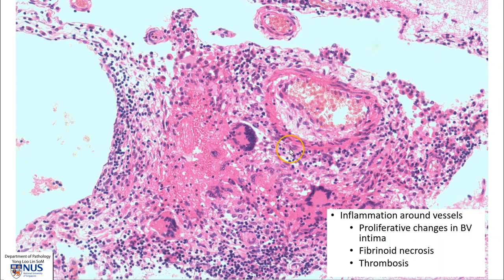Here is one example of a blood vessel with subintimal proliferation. We can see here this granulomatous inflammation comprising epithelioid histiocytes, admixed with lymphocytes as well as many Langhans-type giant cells.